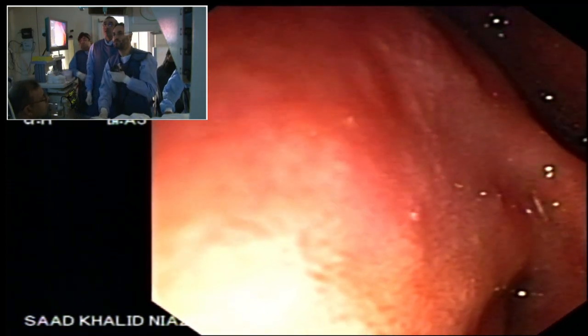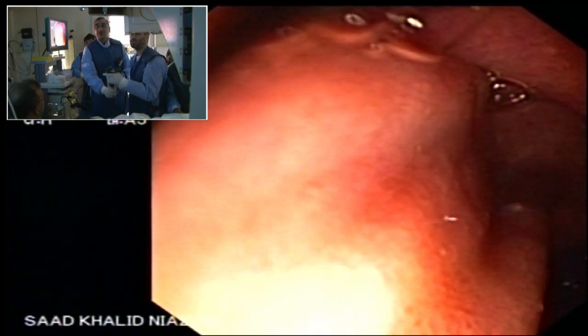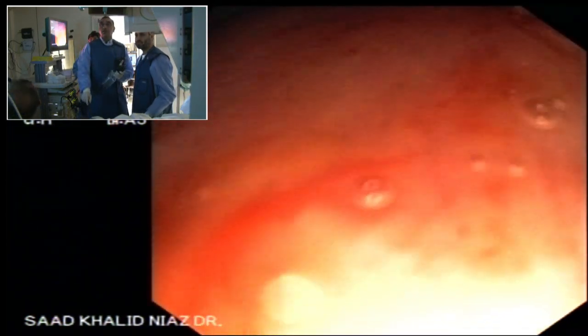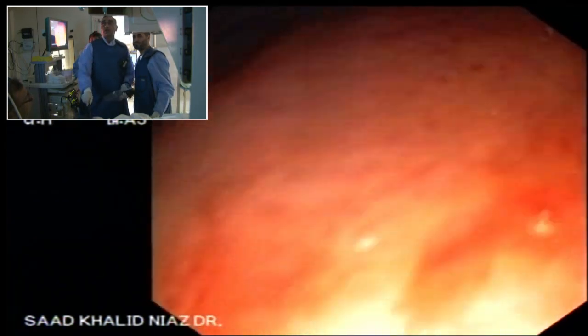No, it's not right. Let me do it for you. Right, okay, go in. But it will fall back into the stomach again. That usually happens if your position is not correct. So again, you go back to neutral position. Every time you fall back into the stomach, you forget to unlock the wheel. So just make a habit. You are just trying to get back in quickly as soon as possible. Just make a habit that you have to unlock the wheel for the scope to get straightened for you.